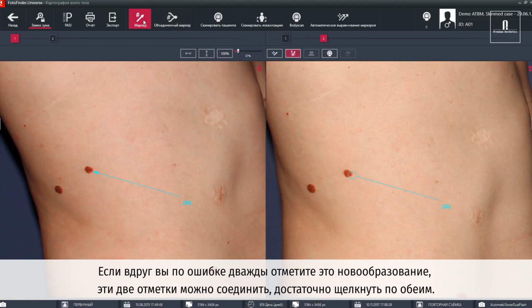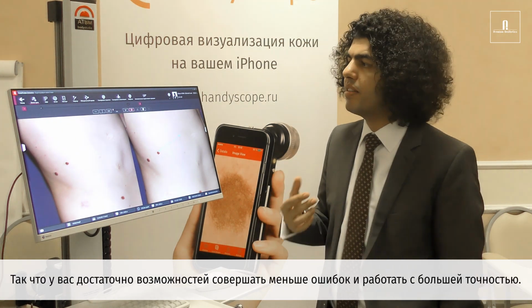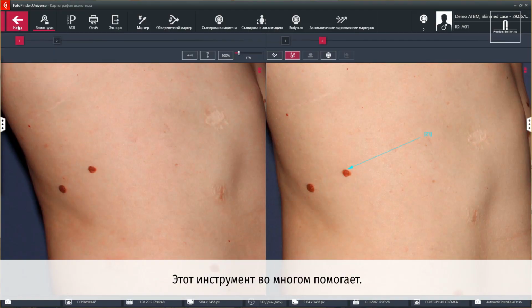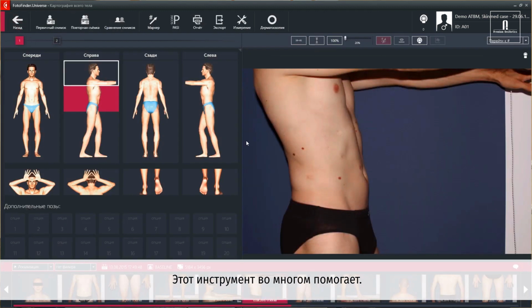In fact, if you go on and mark this lesion out of mistake twice, you have also the possibility to merge it. That means you can just click on both and then merge these markers. And at the end, you will have one of them. So you have many possibilities of making fewer errors and work with higher precision. So this is definitely a tool that helps a lot.